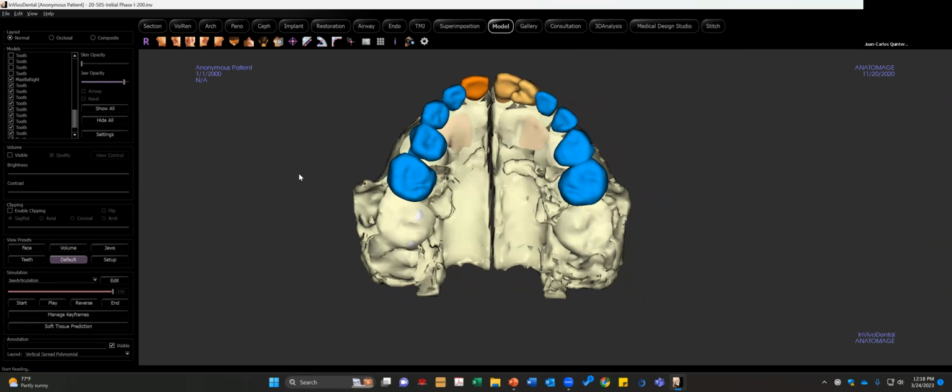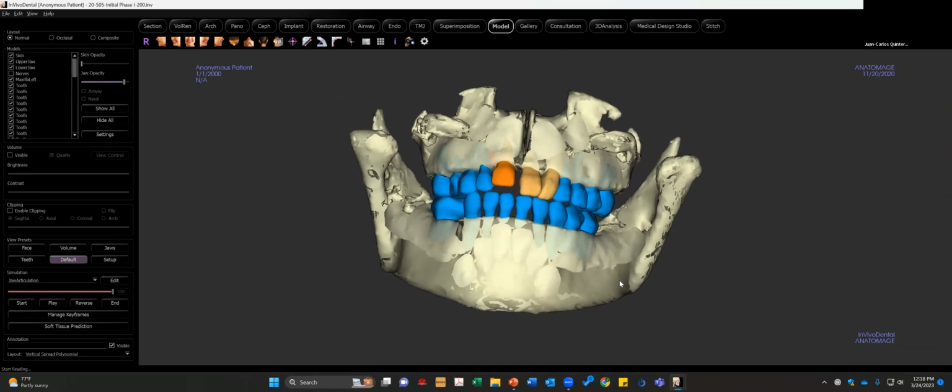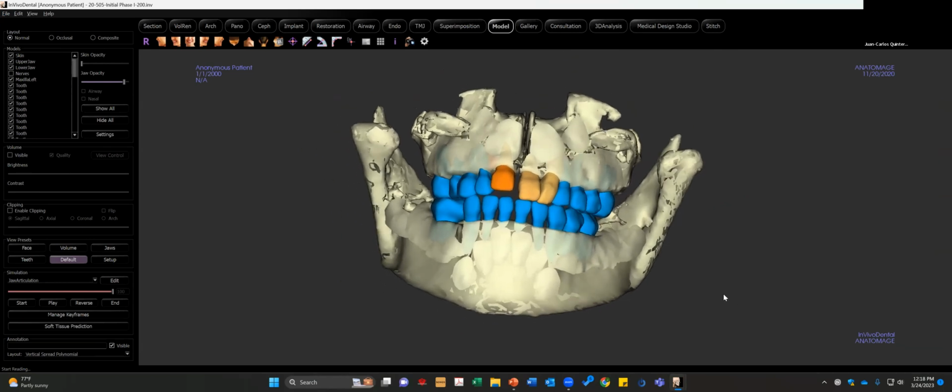So, and speaking of periodontal housing, right? There's, of course, a lot of systems now that will do digital models, right? And they have orthodontic capabilities to move teeth, like many of the aligner companies, right? Which have come a long way. But in those digital formats, teeth know no boundaries.